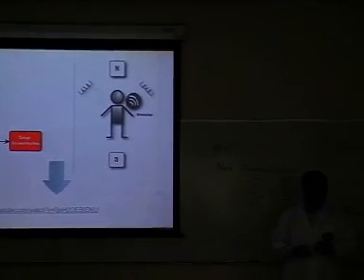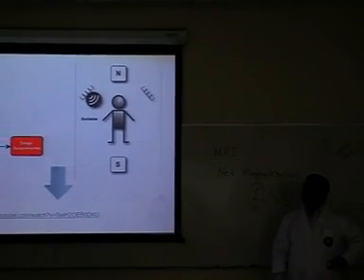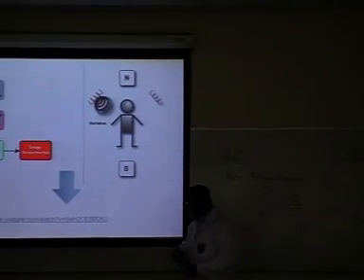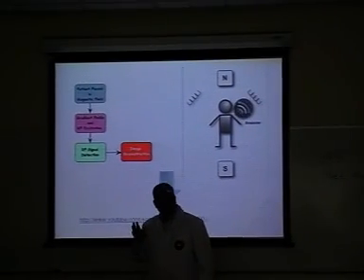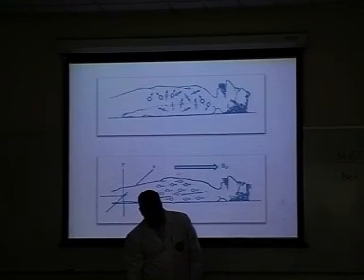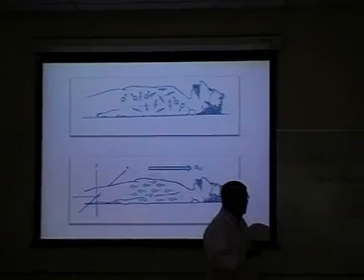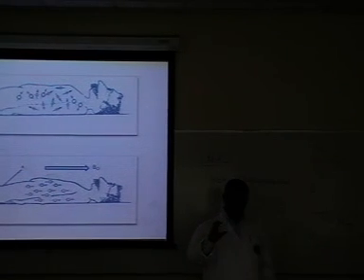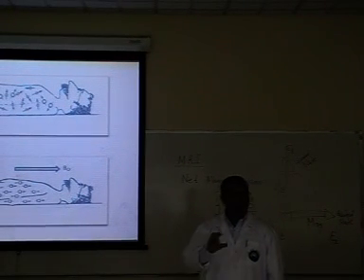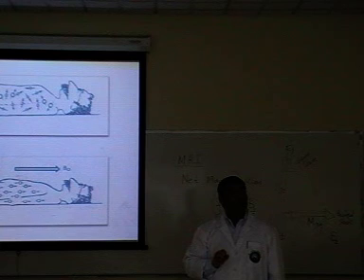And then once I detect that energy, I go to the second stage, the signal analysis procedure. Okay? Is that clear, the picture, what goes on? Because if you understood that, then we can go to the next stage where we see the most important parameters for us to get the MRI signal.